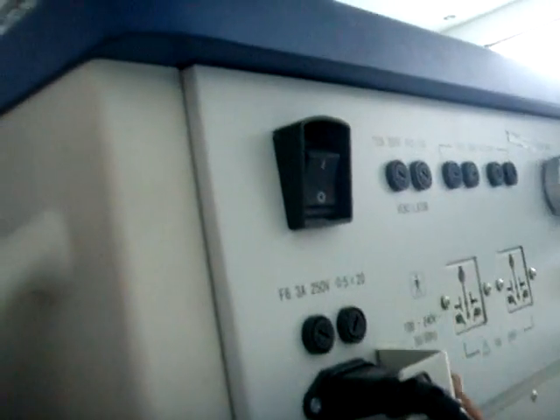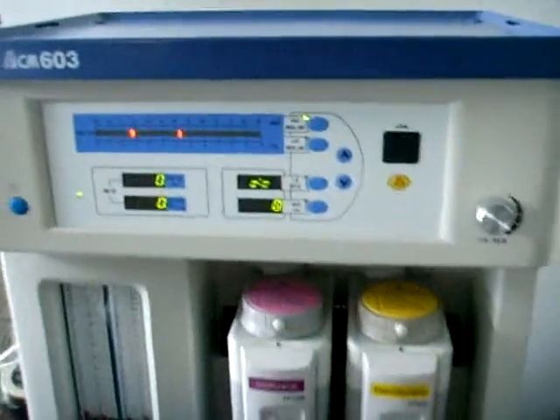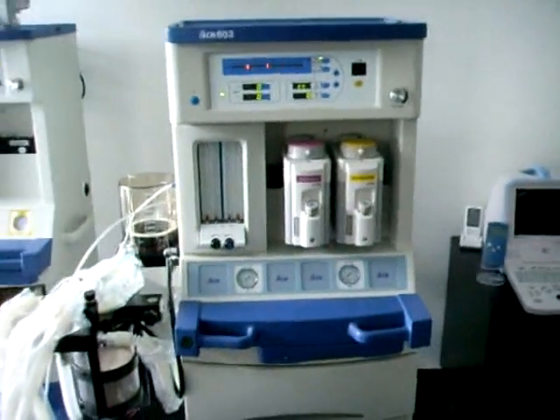Para el encendido del equipo debemos en primera instancia ubicar el interruptor en la parte posterior de la máquina y encenderlo. Después encendemos el interruptor electrónico ubicado en el ventilador del equipo, y de esta manera realizamos la instalación y encendido de la máquina de anestesia ACM603.